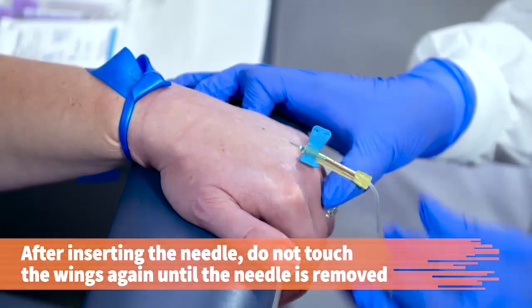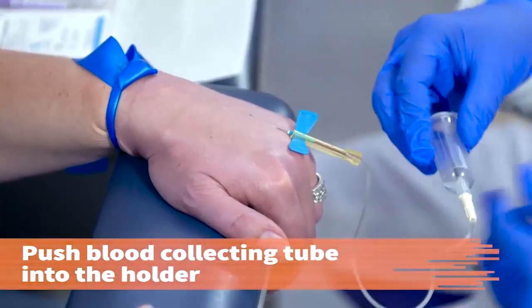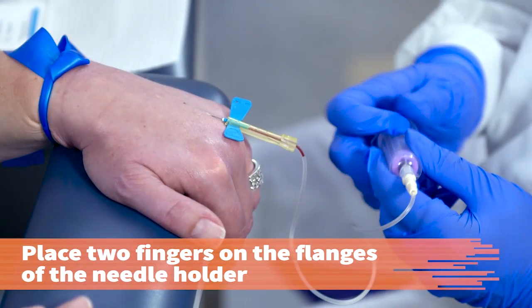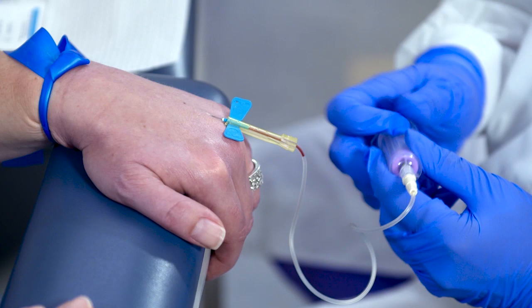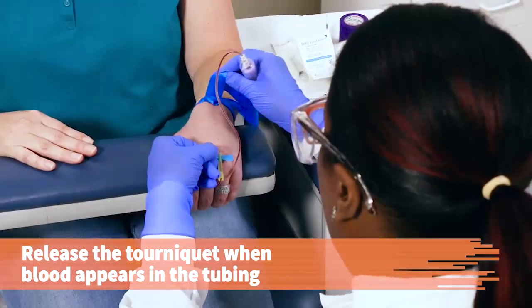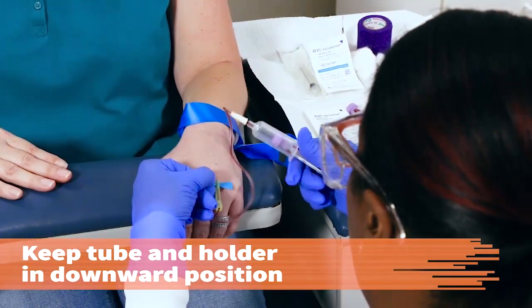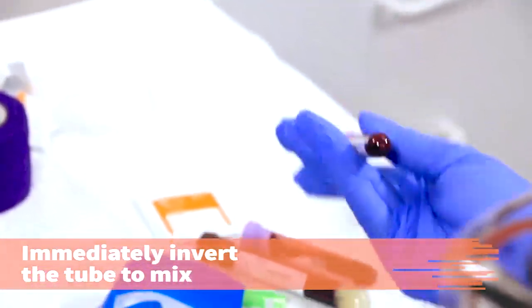After inserting the needle, do not touch the wings again until the butterfly needle is removed. Push the blood collecting tube into the end of the holder. Place two fingers on the flanges of the needle holder and use your thumb to push the tube onto the double pointed needle. Make sure you do not change the needle's position in the vein. Release the tourniquet when the blood appears in the tubing. Always keep the tube and the holder in a downward position so that the tube fills from the bottom up. Immediately after removing the tube from the needle holder, gently invert the tube to mix the additives and the blood.